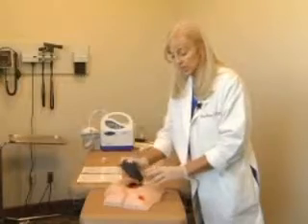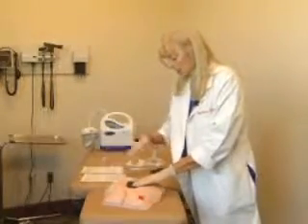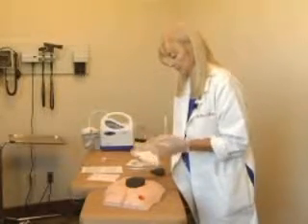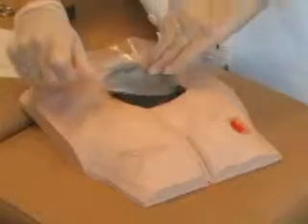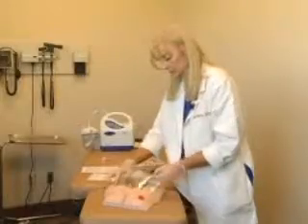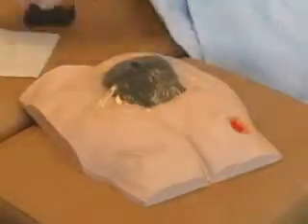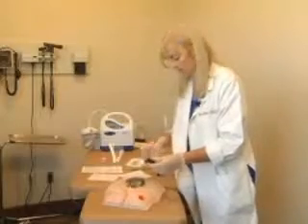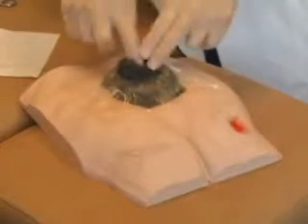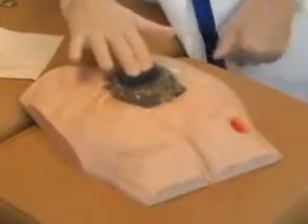For example, if this particular wound were very small and we were getting a closed system alarm, we would want to mushroom on top. We would cover the wound filler with the transparency, cut a hole, and then take some extra wound filler and mushroom it on top. This increases the surface area of the wound filler and improves the airflow of the negative pressure. You would then cover this layer with the transparency and attach your dome connector on top of the mushroom. That's considered mushrooming.